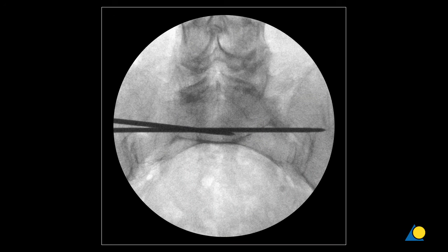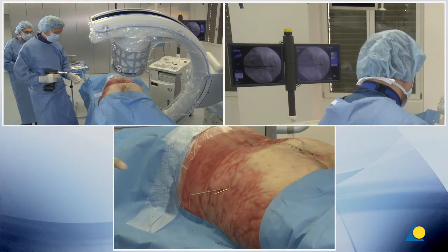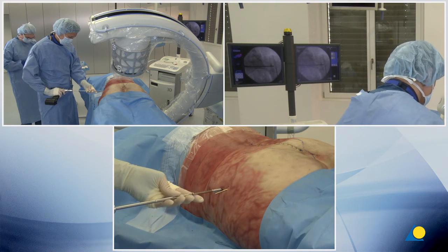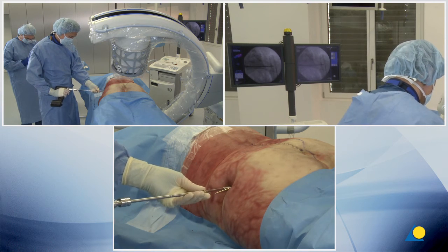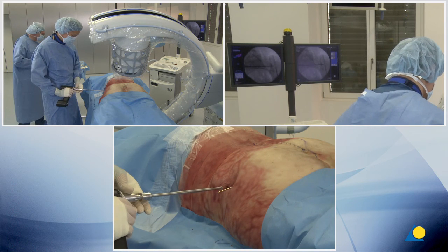Once assured that the guide wires are positioned correctly, the length of the screw is determined. In this situation, the surgeon is using self-drilling and self-tapping screws. The screws are inserted with power until almost seated and then tightened by hand.